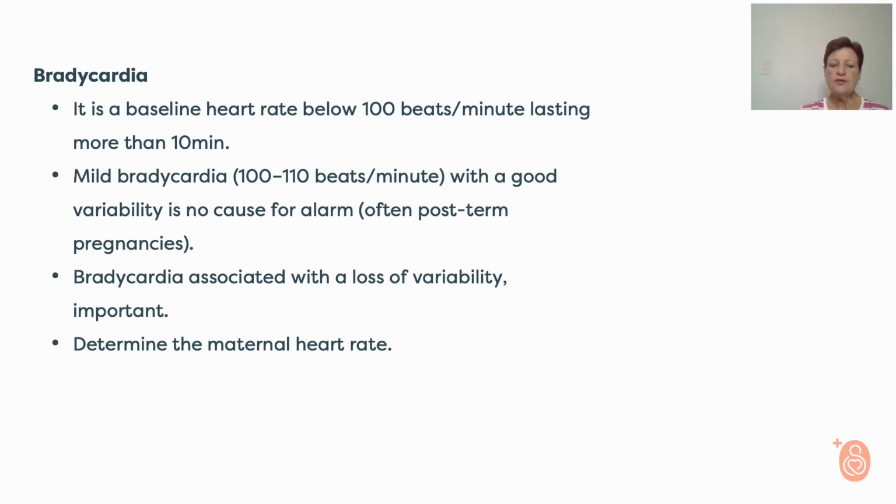So we have to record the maternal heart rate with a CTG on the graph, and if that's not possible, we have to do it manually and then write it on the graph.